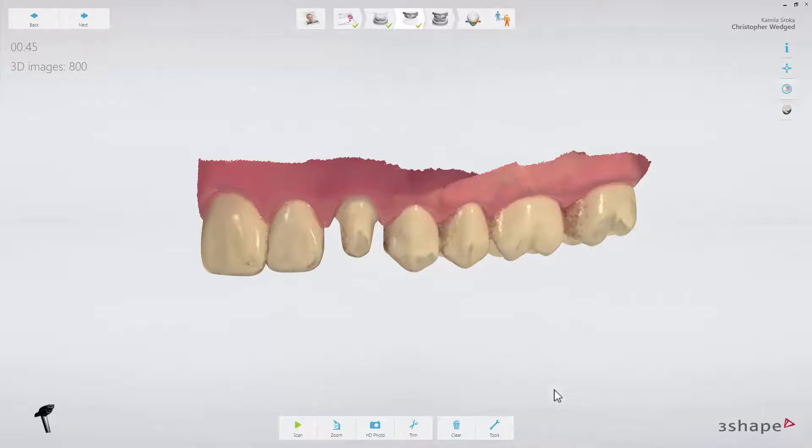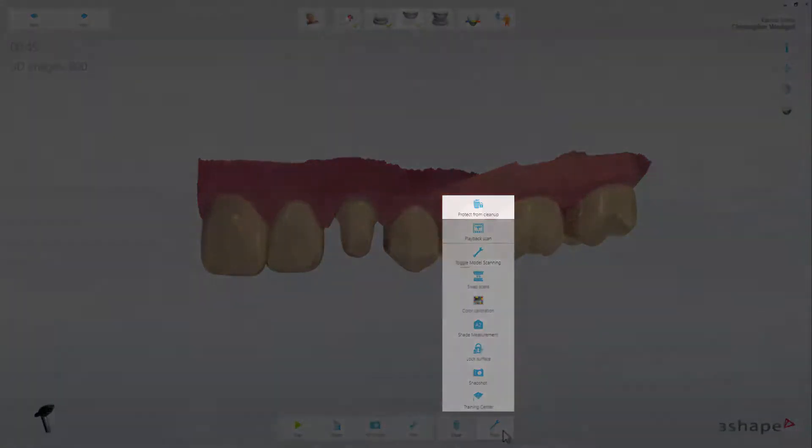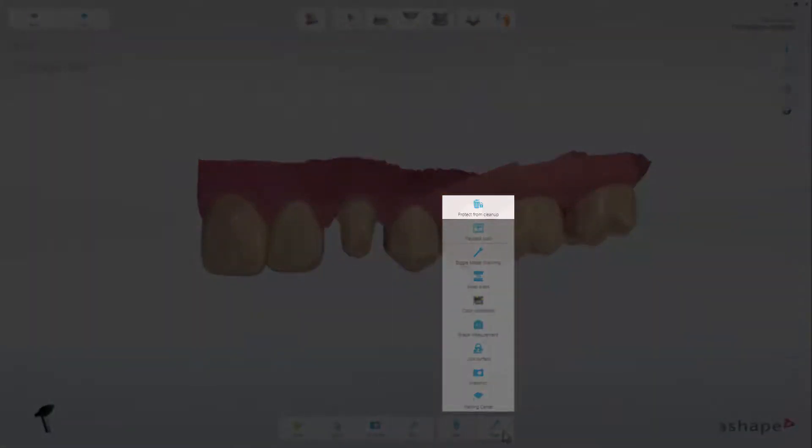Tools opens even more possibilities, from the top. Protect from Cleanup will lock the complete case, including all scanned streams. Cleanup makes sure that your system stores all important details and 3D information. You would only use this function if you need to rescan or add more to this specific case over a longer period of time.